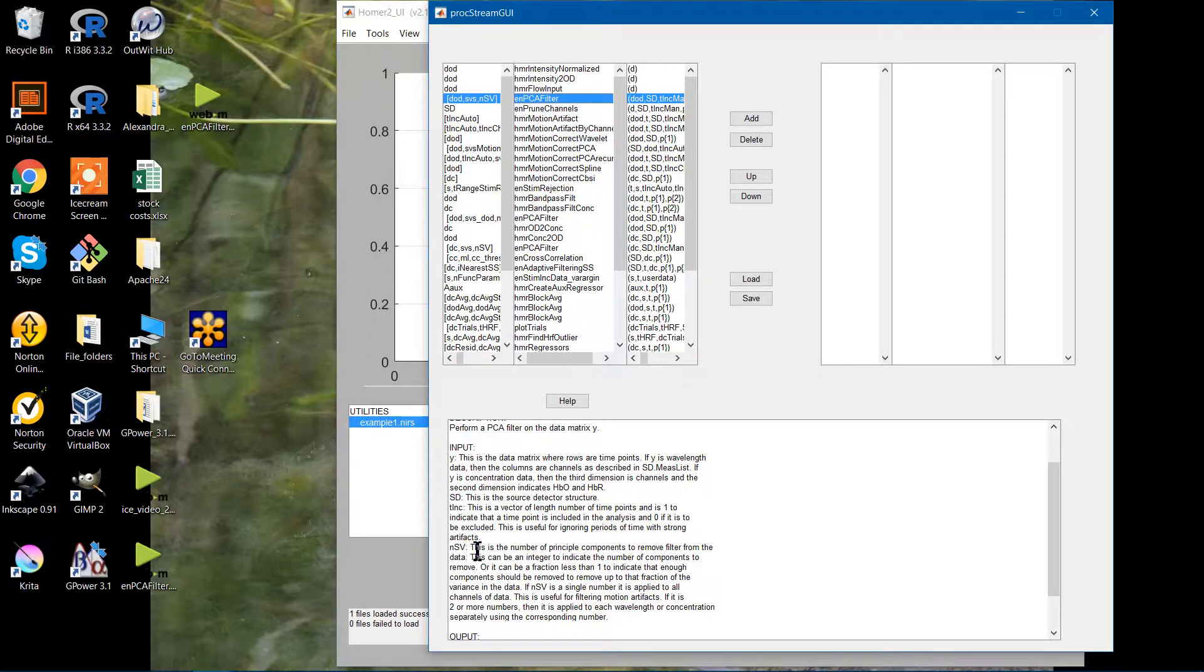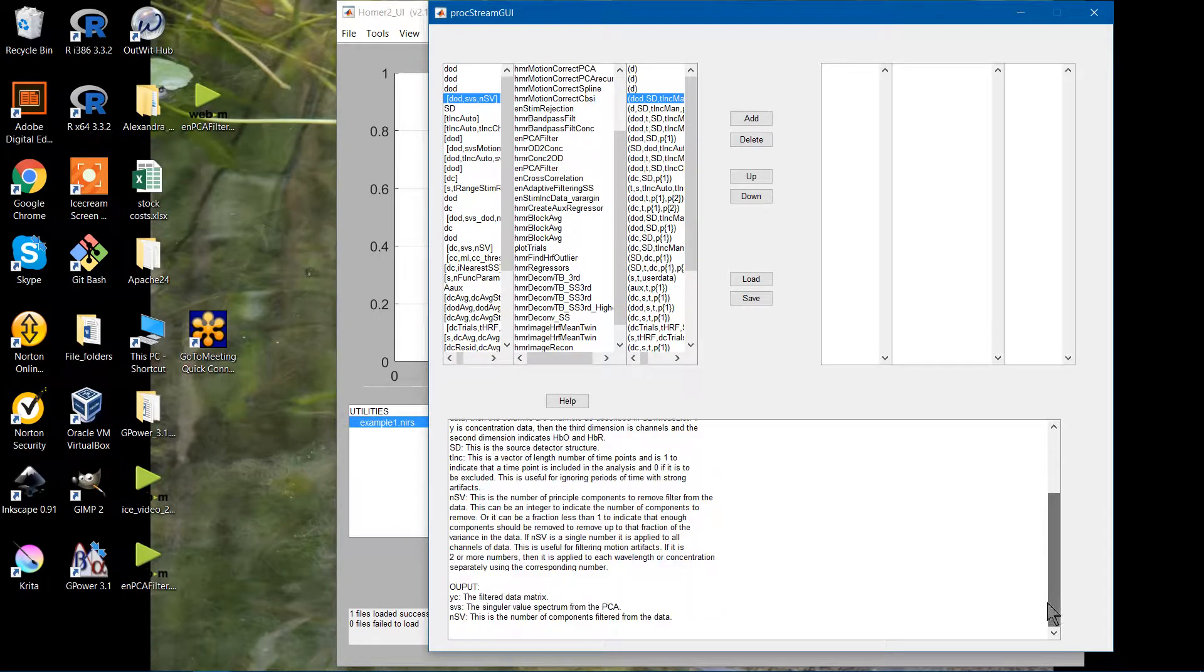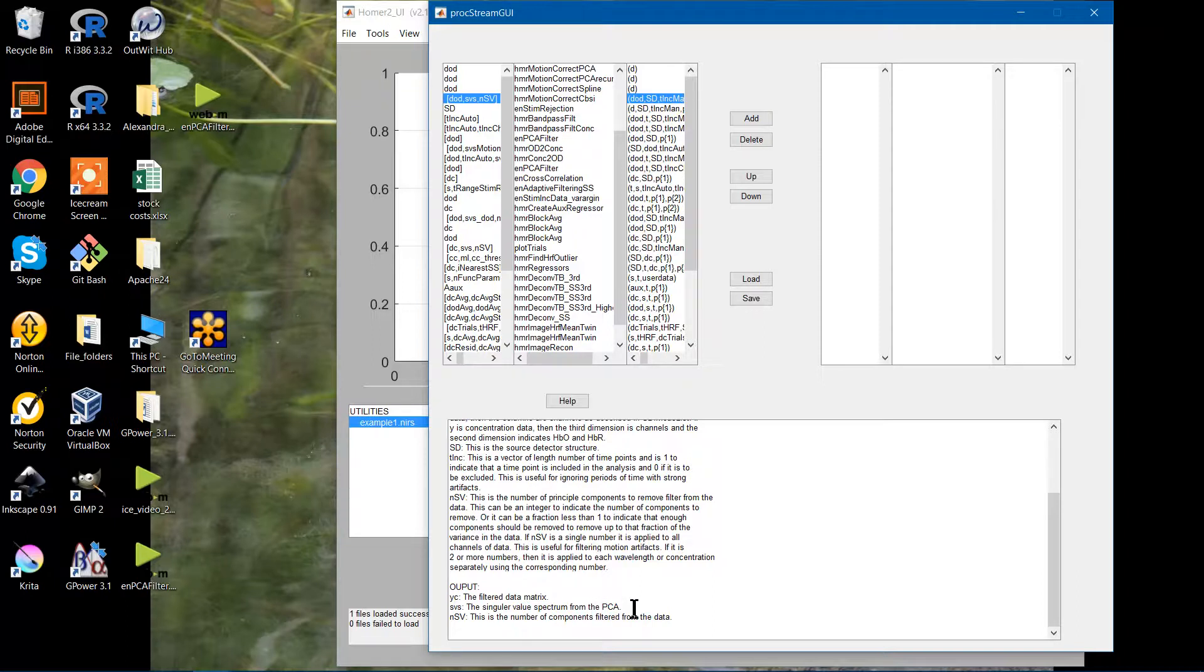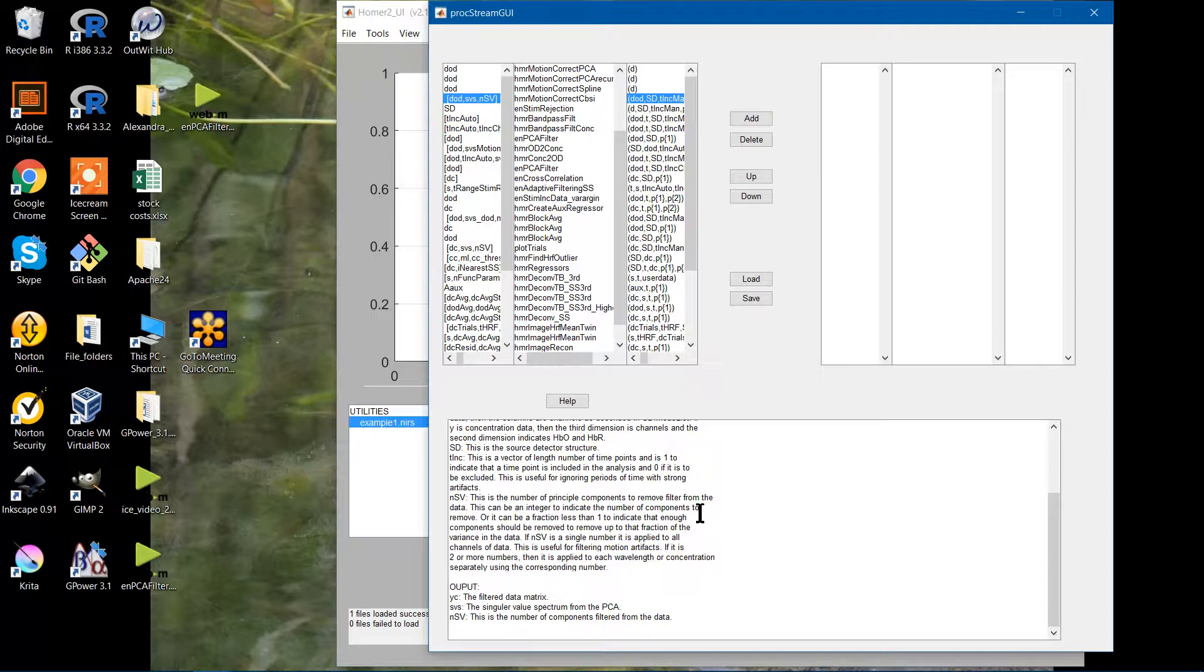The NSV is going to be how many components you want to actually remove. And then your output, which is down here at the bottom, will be the filtered data. Your SVS, which is the singular value spectrum, is part of the singular value decomposition in the PCA. A bunch of fun, wonderful math that you can go much more in depth on from someone other than me. The NSV is also your output. This is how many components were filtered from the data.